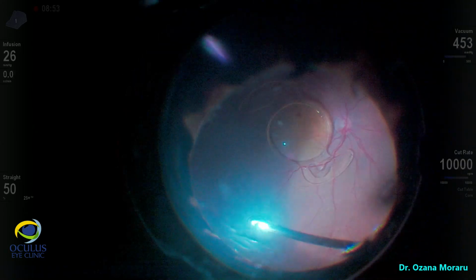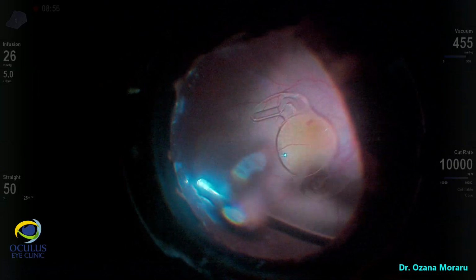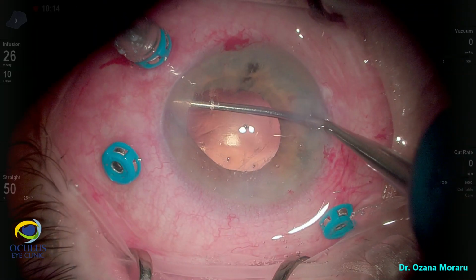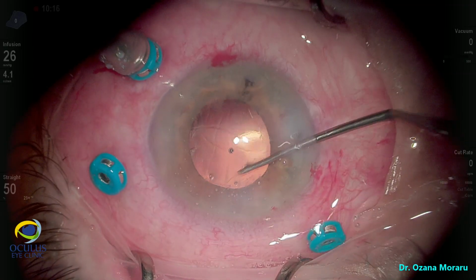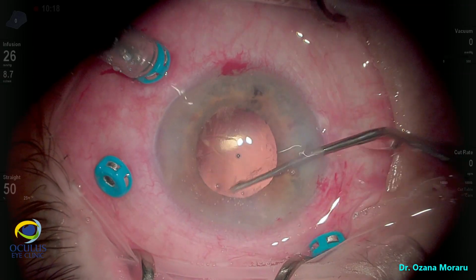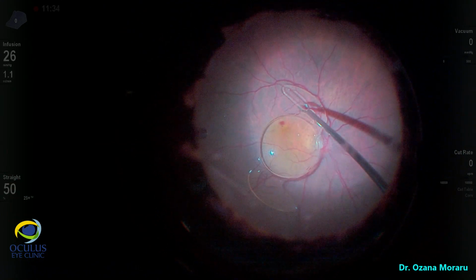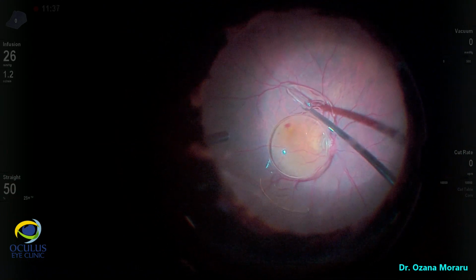And the decision was related to the status of the anterior capsule, the capsulorhexis, which looked quite good and complete. So we decided to remove it completely and to use another IOL to implant on the anterior CCC.